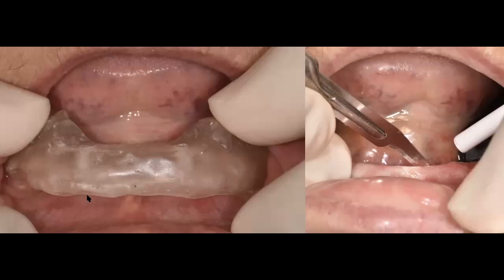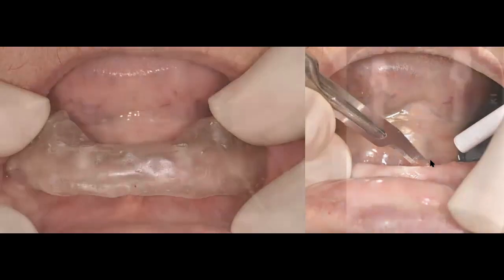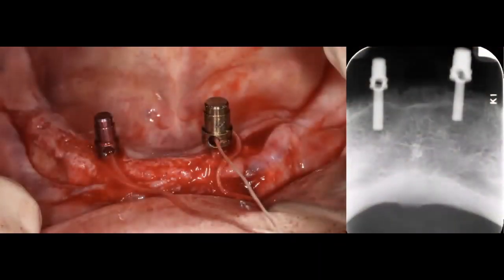Once you remove this guide, you create your incision and open your flap, and you're going to see those bleeding points within the bone. Now you're able to just follow those drills. You can place your guide again, go with the pilot drill, remove the guide, and now put in your paralleling pins to make sure that you're nice and parallel in the intended location that you had planned initially in your CBCT. And that's what you're seeing here.